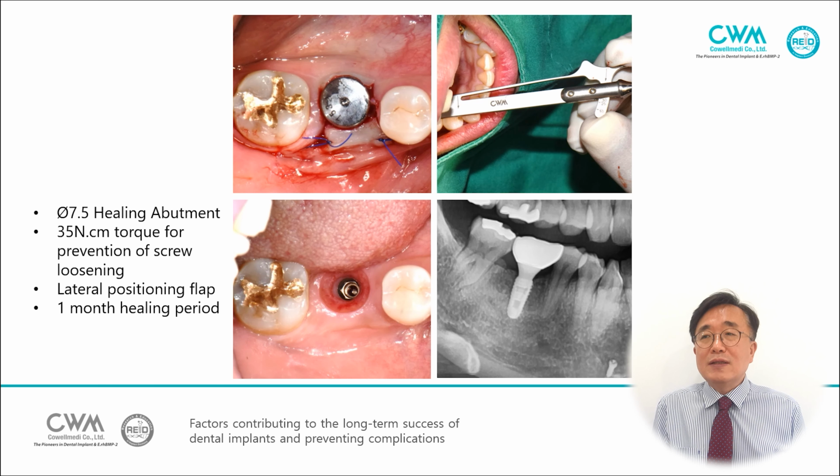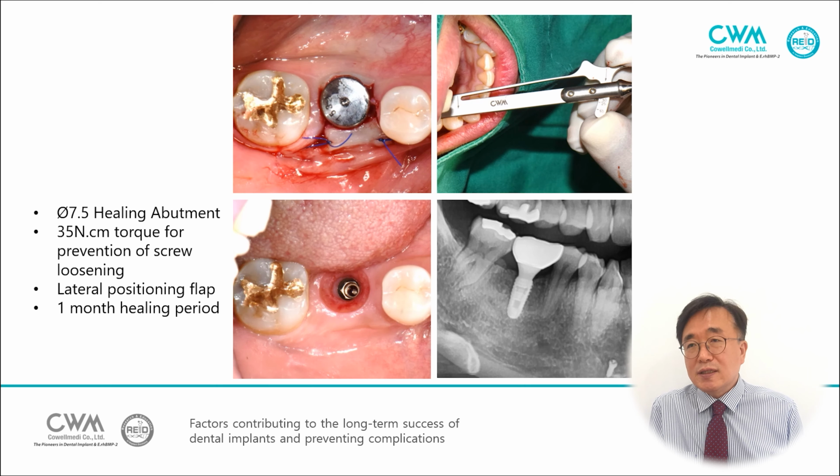After a 1 month healing period, the gingival emergence profile is established, and the implant restoration was made. So we can control the depth of implant placement with the implant drill.